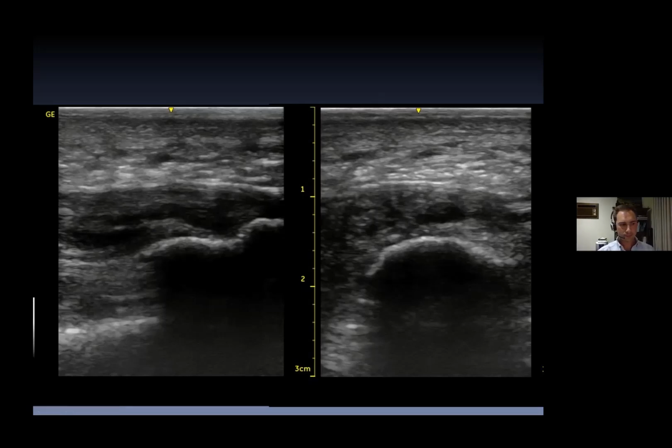There's another follow-up question here. So James, where would you treat in relation to the heel spur if not on the spur? I basically treat at the insertion, pretty much right where it drops off. Again, you're looking generally for maximum tenderness. I'm treating that plantar area. So my shockwave would be pretty close to the spur because I'm treating that osseous ligamentous insertion point.